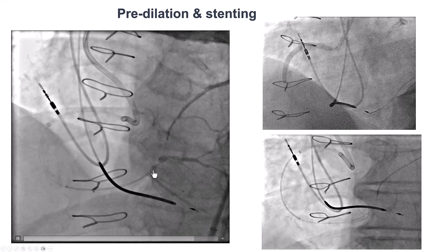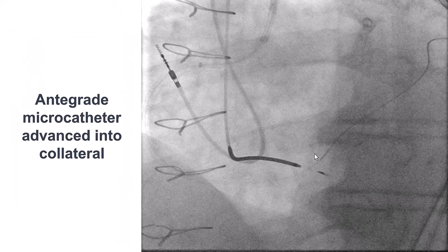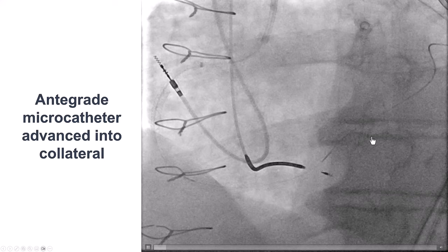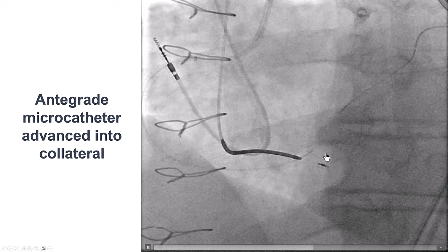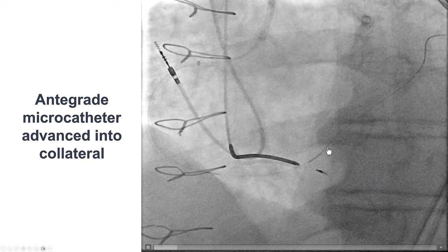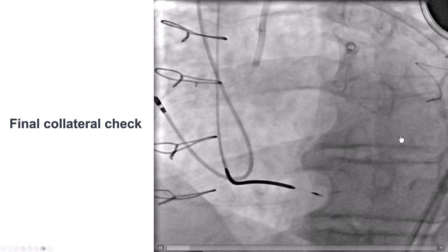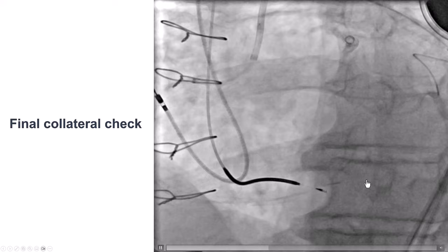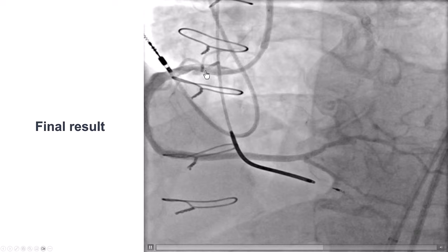We decided to stent into the posterolateral — long stents, essentially all the way to the ostium of the right coronary artery. After we were done stenting, we wanted to remove the retrograde equipment, but there is always the concern about damage or perforation of the epicardial collateral. To minimize risks, we advanced a microcatheter from both directions — antegrade and retrograde — then removed the guidewire and injected from both sides to confirm no perforation. There was indeed no perforation, and a nice result was achieved with good flow into the distal right coronary artery.